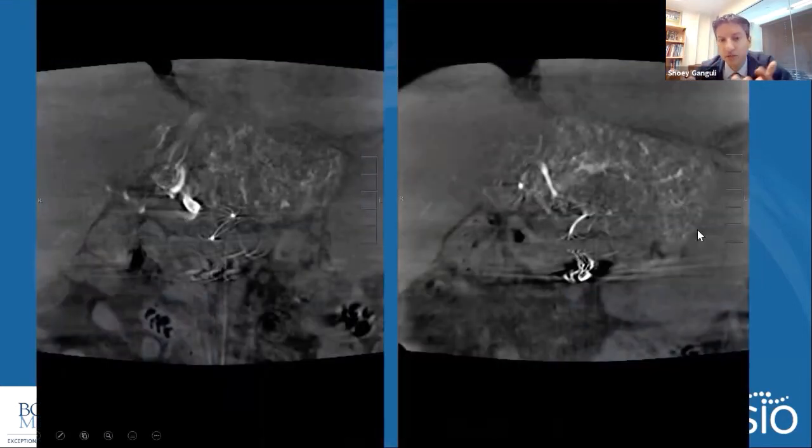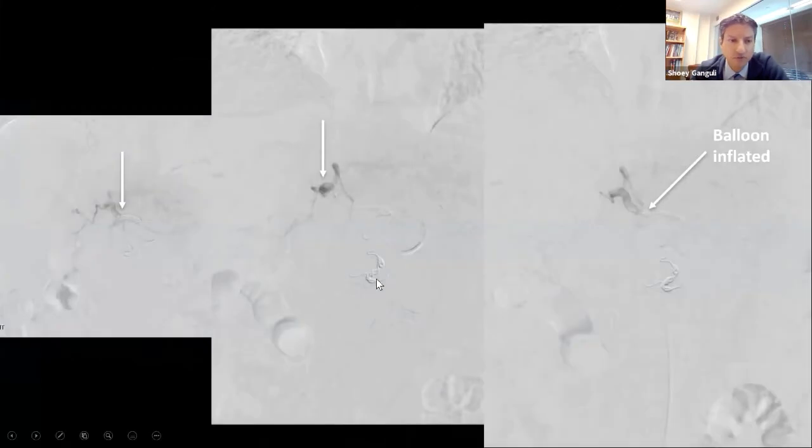And so the thought was to do like a lobectomy here, and I wanted to inject a larger amount of activity and also more particles, but I didn't want to reflux it into the right side, given this is a liver transplant, and preserve that side.